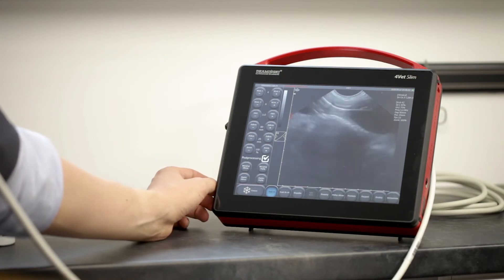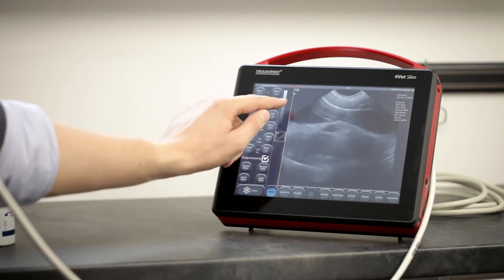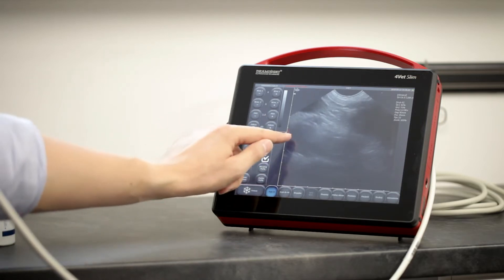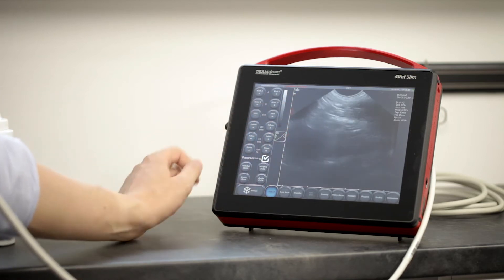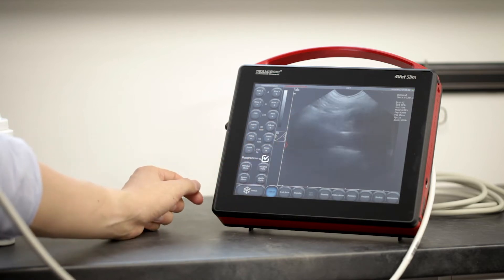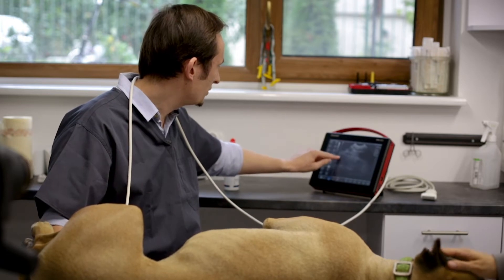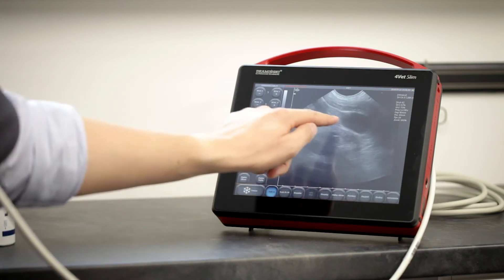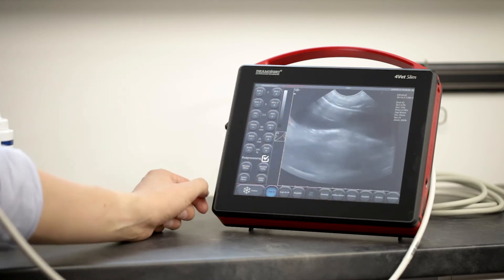What is important when I'm focusing on some region is to remember to put the focus level on the level of the structure that I'm looking at. Right now we are adjusting the focus — you can do it by hand or by pushing the buttons. Once again we are watching the uterus here. I will increase the gain a little bit; here we have this structure on the longitudinal section under the urinary bladder.